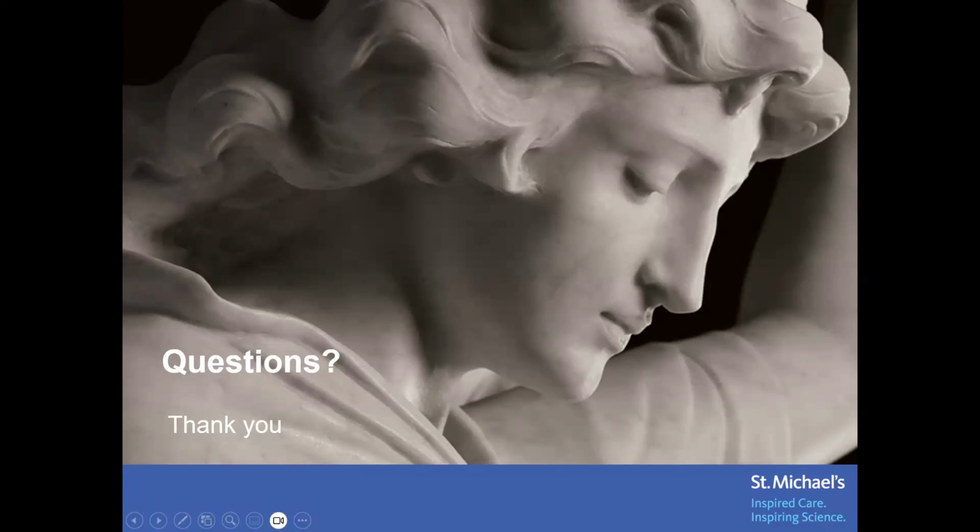So I think we should still use the central one, but be aware that you're more likely to have pressure recovery and more likely to overestimate the gradient when you have bileaflet valves. When I was looking it up, I wasn't aware of any recommendations to look at the lateral jet and the central jet and average the two.